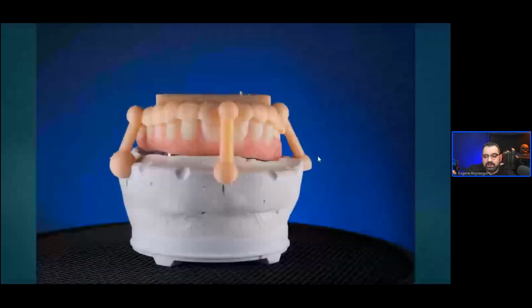And if you're dealing with, for example, implant cases, and I'll be showing in other lectures on actual cases, start to finish, how we deal with this. I love doing these cages for scanning, to create bars, and also for resetting cases. Before I had digital, I actually had to do these things with special articulators and putty and everything like this, and it just made things a little bit more problematic. Now that I do these digitally, it makes it a lot easier.